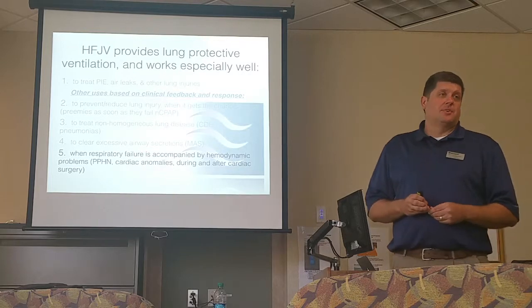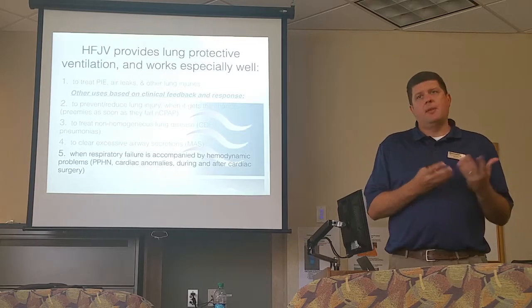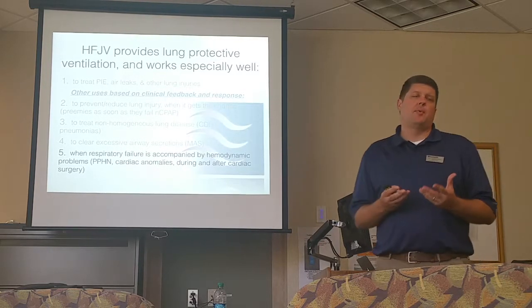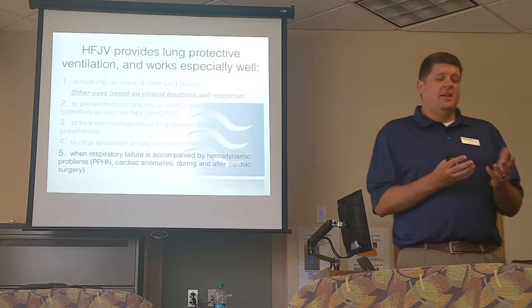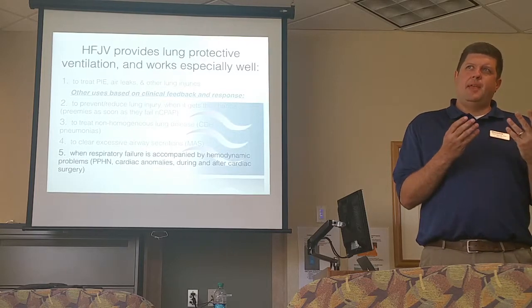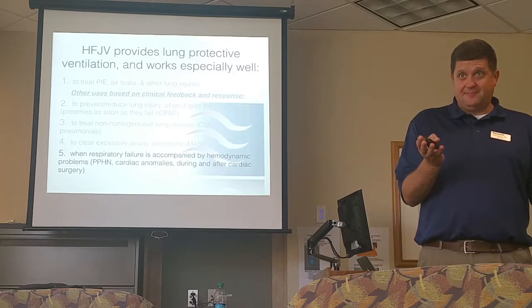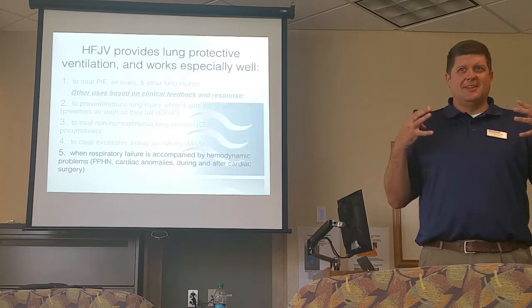Number 5 is one where we're seeing a huge growth in use of the jet. Patients who are hemodynamically compromised. These are ones where I see a refractory hypoxemia type picture develop. Often we have a little baby who's not doing so great. We'll throw them on an oscillator. And then you have 2-3 days where things are pretty cool on an oscillator, right? And then by the 3rd day, the x-ray just starts to blow up a little bit.